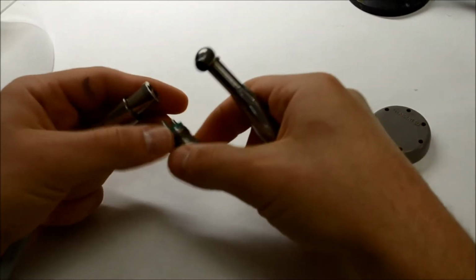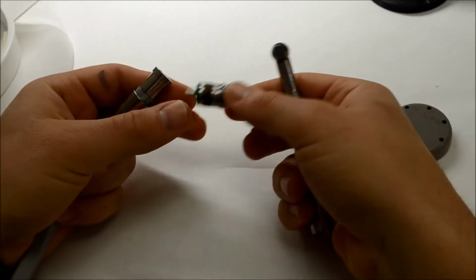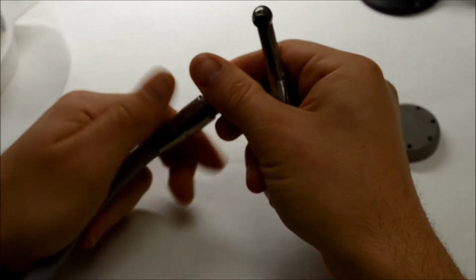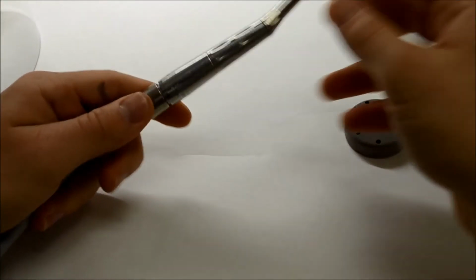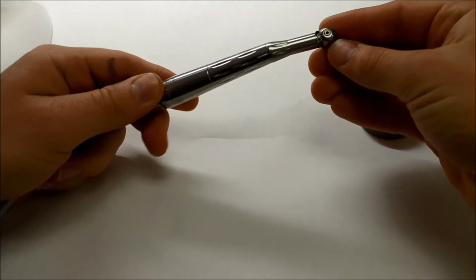They consist of the main handpiece section where you put the drill in and you sterilize this, and this is the connector. The connector goes onto the hose and you screw it on, and the handpiece just pops right into it. You can do that. You can put the connector into the handpiece first, it doesn't really matter. The ones in our kit are a little bit different looking than this, but most handpieces work in the same general way.